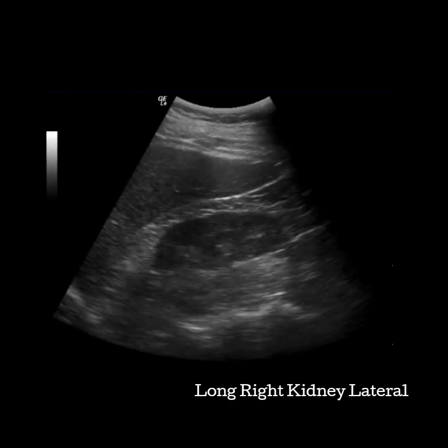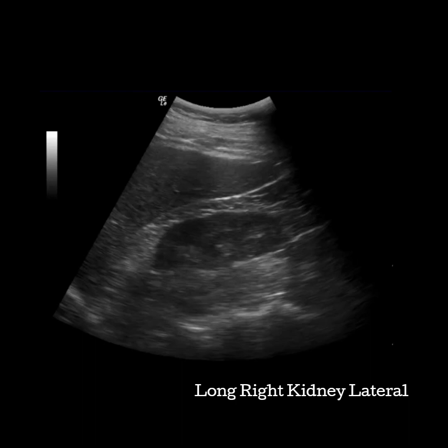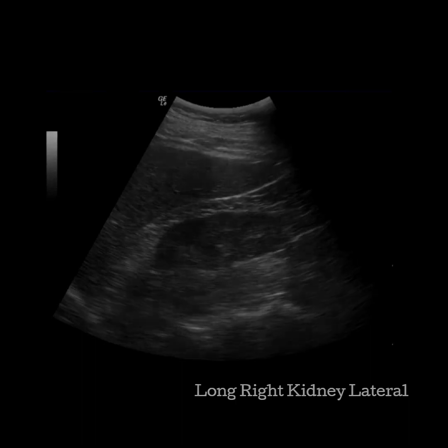Try to find a good representation of the kidney at mid. You will fan your transducer towards the patient's right, watching for the sinus to disappear. When you have a good representation of the borders and the kidney parenchyma, stop and save an image at the lateral portion.